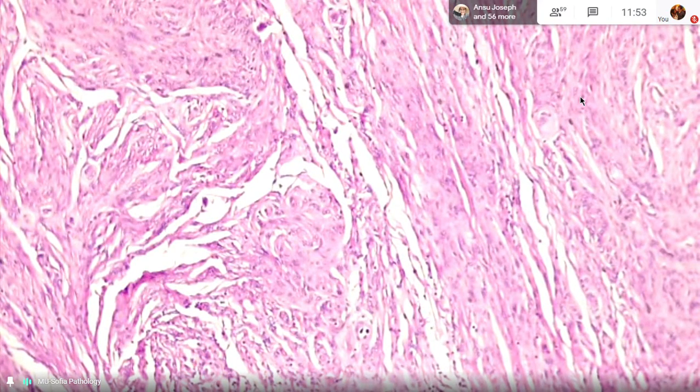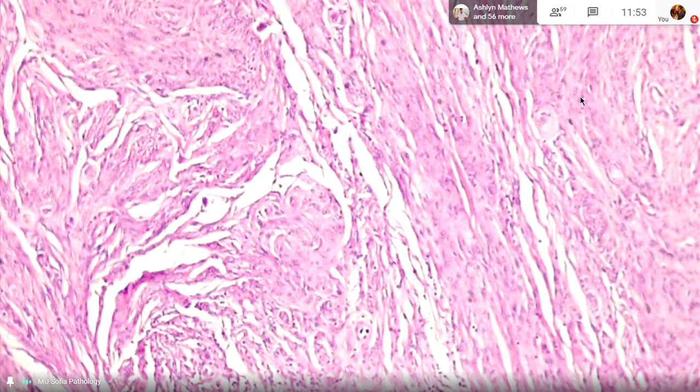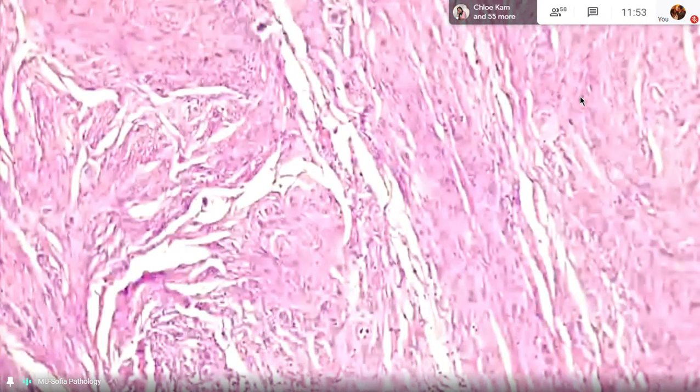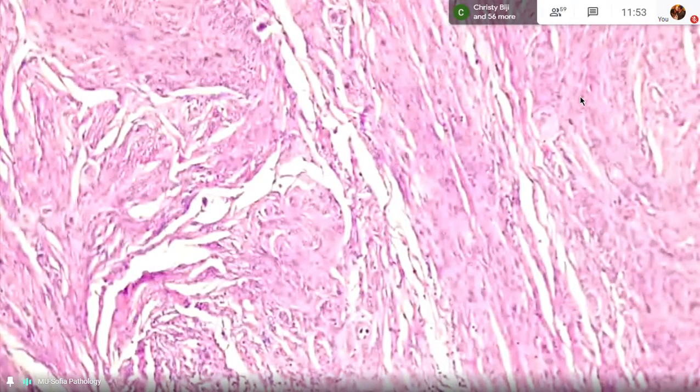Of course, we can have different histological types of meningioma. You can have the syncytial type, more sheet-like without any organized pattern of growing. You can have the transitional type or fibroblastic type or psammoma type. I'll show the psammoma type later on. But as we've discussed, this meningioma should be first-grade malignancy because there is no polymorphism.